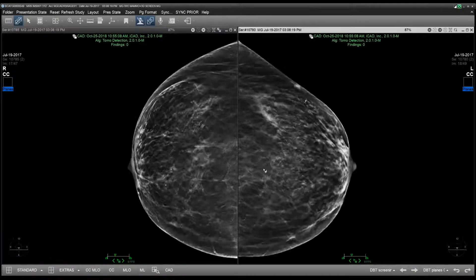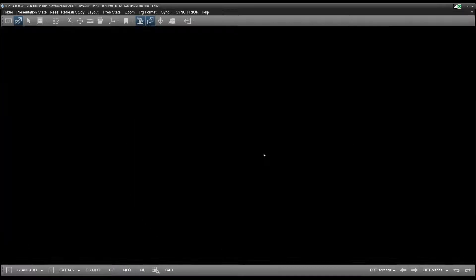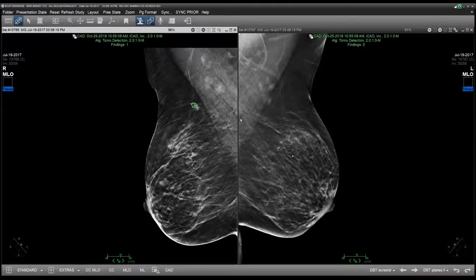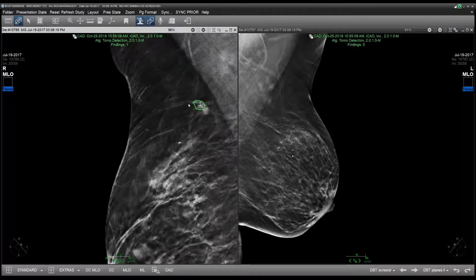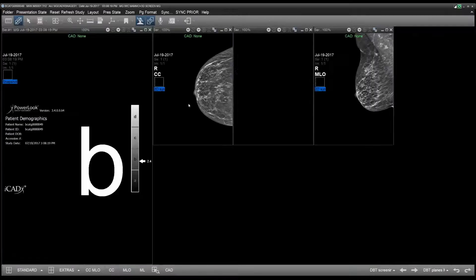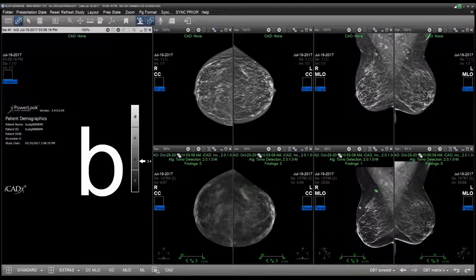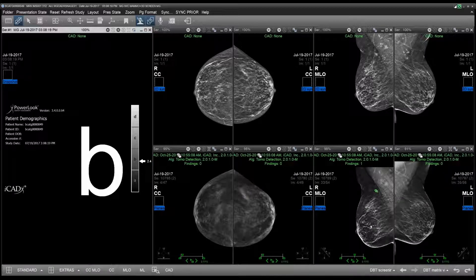Configuration options also allow the viewer to suppress the AI findings until the radiologist is ready to view them, so as not to influence the read. In this way, the AI can act as a second set of eyes or to assist in the decision-making when the radiologist wishes.